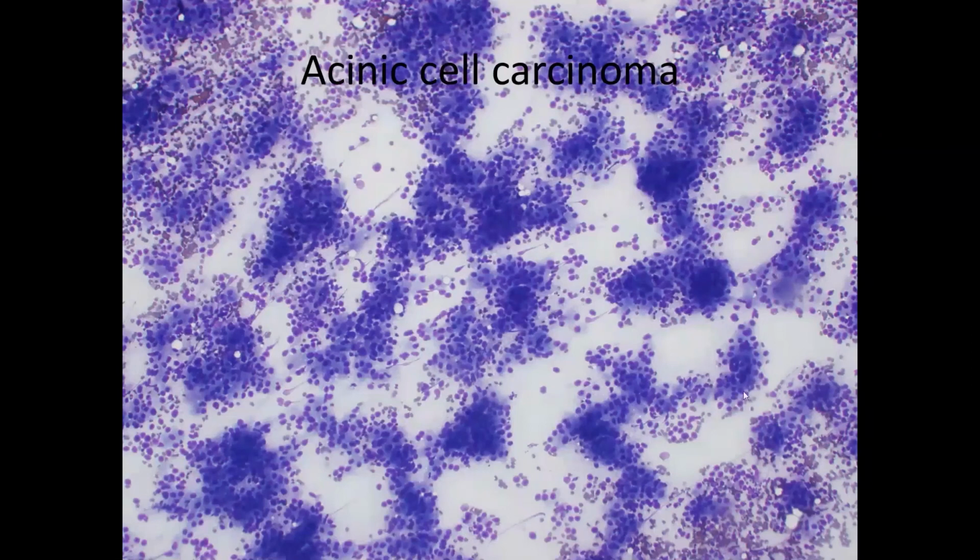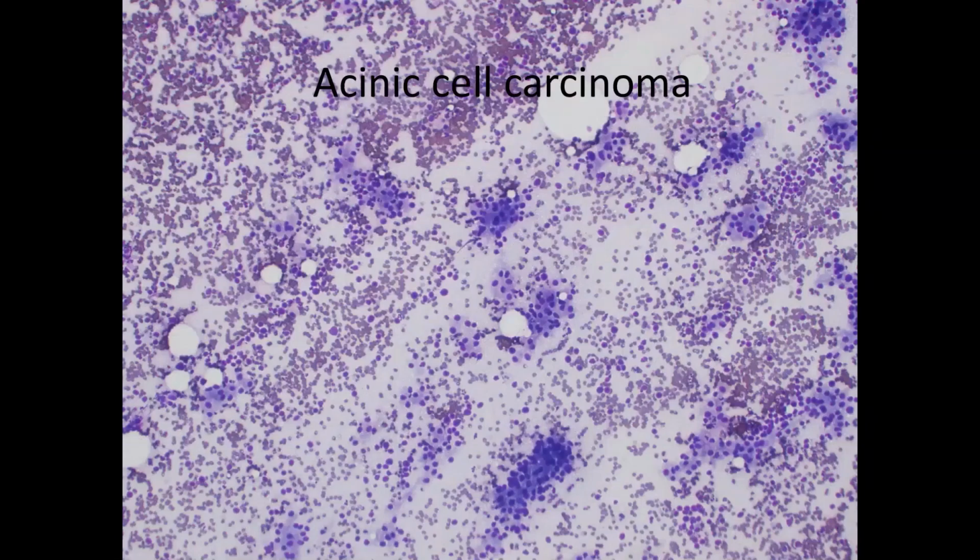an aspirate is going to be three-dimensional heaps of tumor cells forming clumps and irregular groups, and in the background you'll see numerous stripped naked nuclei. So that combination of three-dimensional heaps of cells as well as individual bare nuclei in the background is very suggestive of an acinic cell carcinoma. Again, three-dimensional clumps of cells as well as naked nuclei. That's going to be your clue at low power.